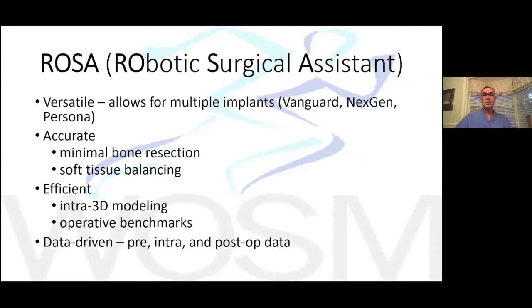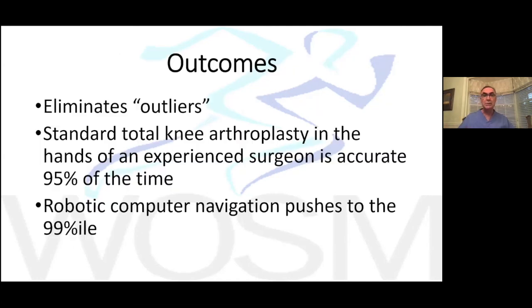This or the further iteration of the robotic surgical assistant that's sure to evolve in the future will change based on the post-operative data that we gain over the next years. Including hips and knees, we do well over 1 million of these a year in this country. So there's lots of data-rich opportunity to assess and to review the statistics on this as we go through real time and into the near-term future.